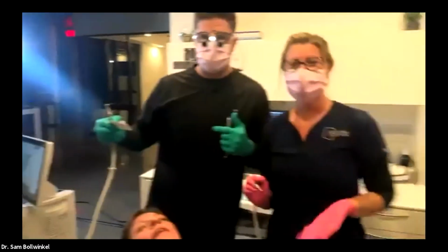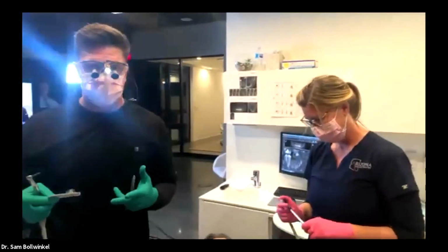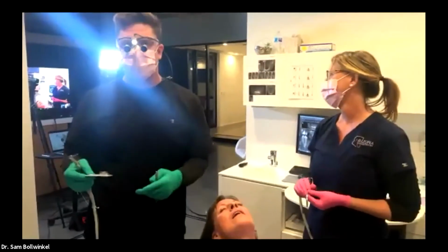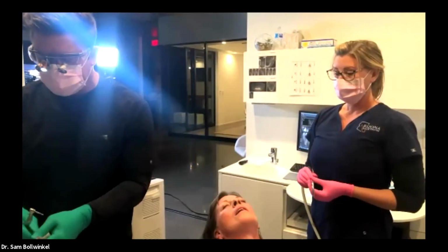All right, guys. We are getting ready to place the implant. So we're just taking the implant out. If the cameraman wants to pan out a little bit, number 1, look at the team that's behind me. It's just me and Kim and Carrie. So if you're thinking there's a huge production crew here trying to figure out how to do implants, it's just the three of us doing this. This is everyday stuff. This is what I do in my practice every day. This is something we can teach you, and with the technology, really provide a service for your patients.